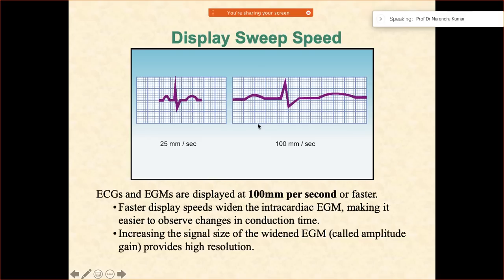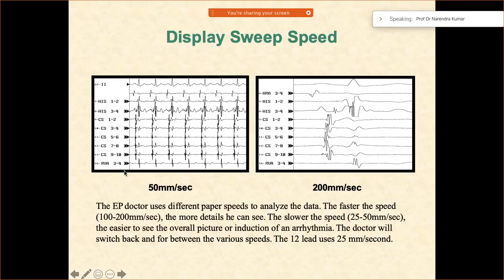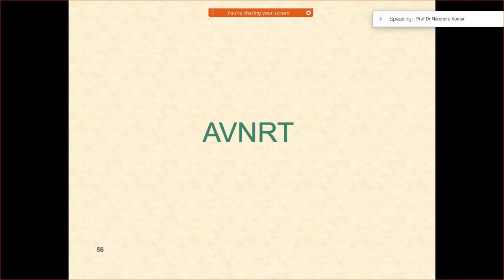What is display sweep speed? Similar to the surface ECG, for intracardiac ECGs you can read them at whichever speed suits you better. Notice the differences: at 50 mm per second this is how it looks, whereas at 200 mm per second it looks different. You can vary the display speed. After going through all these basics, we can now give some real good insights about the first and most common supraventricular tachycardia that we see.